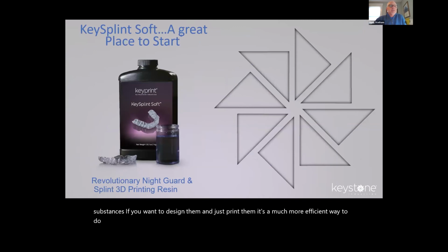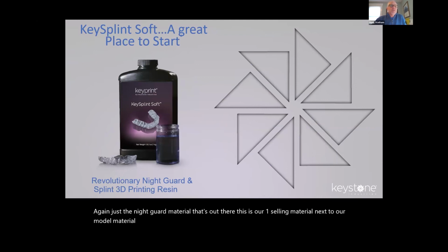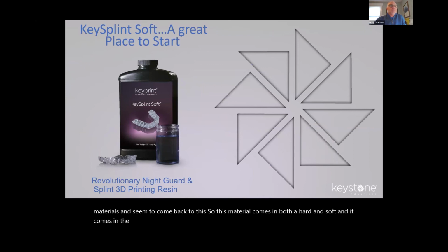Again, just the night guard material that's out there. This is our number 1 selling material next to our model material, volume wise, but this has been a tremendous product. There are some competitors out there now, but what we're finding is a lot of them try the other materials and seem to come back to this. So this material comes in both a hard and soft, and it comes in the traditional tinted version, or it comes in a clear version.